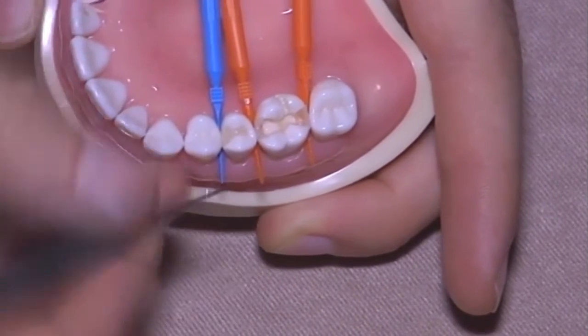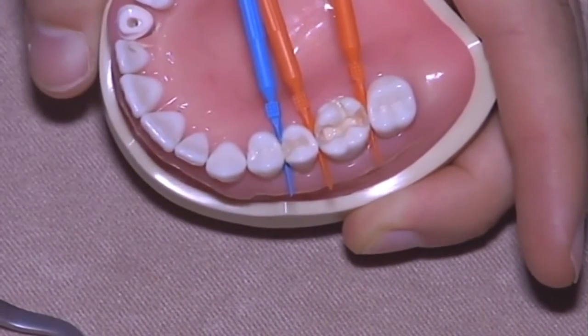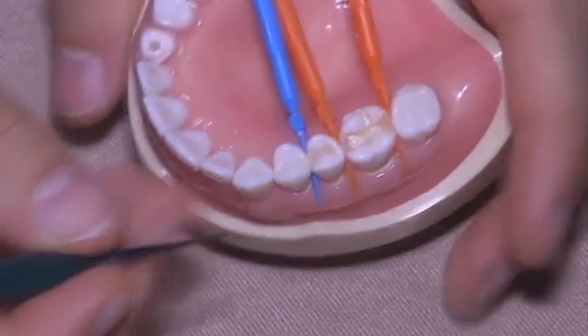Pay attention to the composite which can drop inside the marginal area.